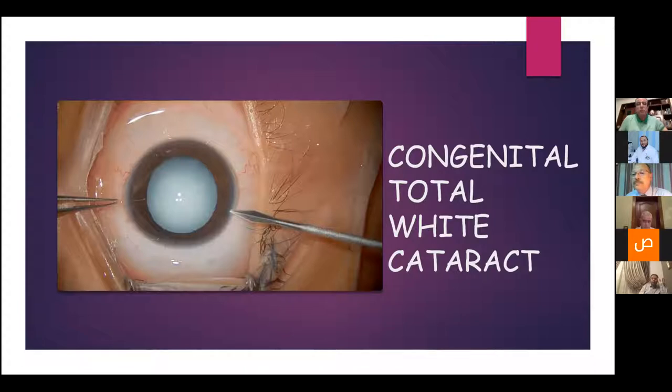Okay. There's another question. When radial extension happens to the posterior capsule, especially in mature cataract, is it better to convert to extracapsular or do you continue with the safest maneuver, which is best for the patient? Of course, it depends on your skills, your experience, and when and how to shift. If you are a beginner, you shouldn't go for a difficult case. But if you are an expert and you can manage, you can go.